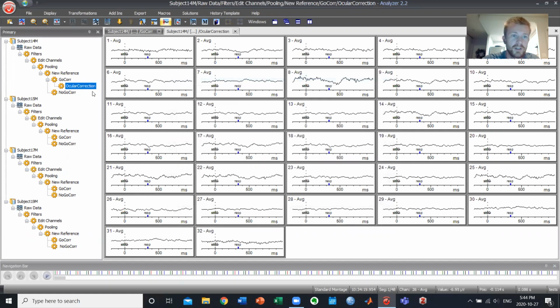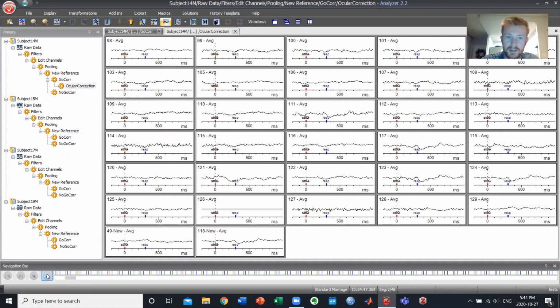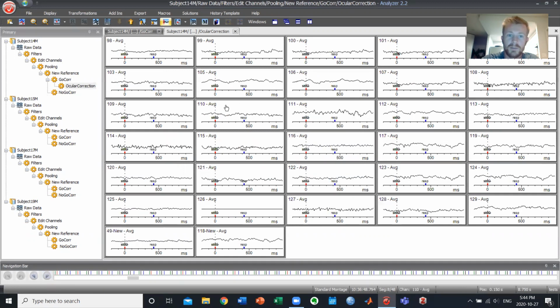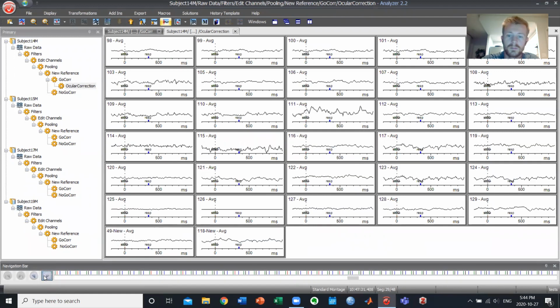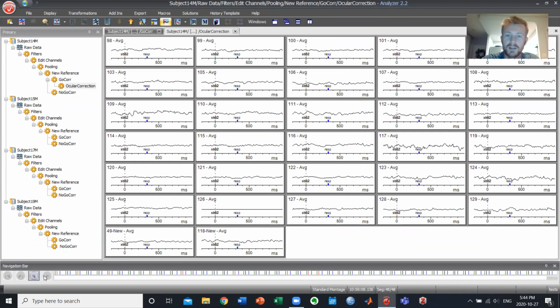I'm going to go and check through my trials, make sure all the channels are here, to make sure that I don't see any blinks, just to make sure that's correct. I'm just going to do this really quickly. And you would be able to see a blink. It'll show up as a nice big peak. And it didn't recognize any blinks within the trials that I've segmented, and that sounds about right to me. This is pretty clean data.